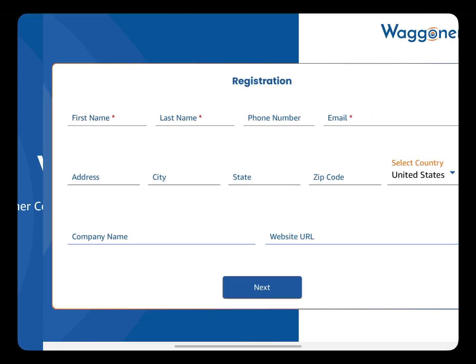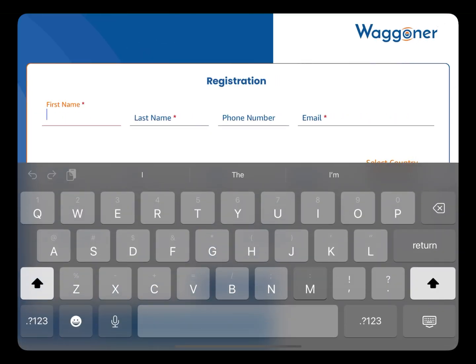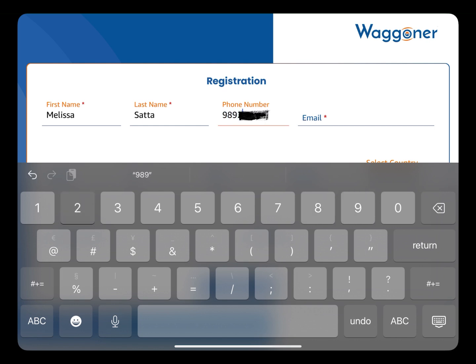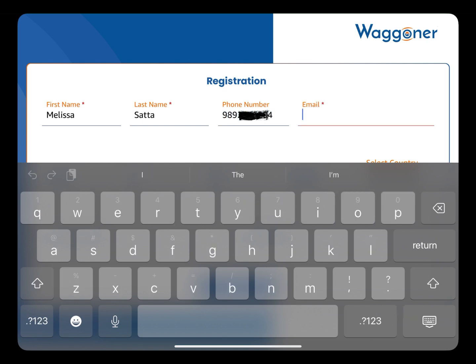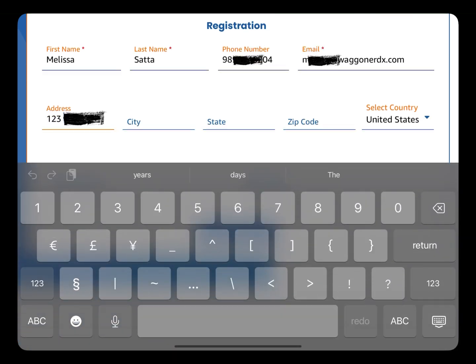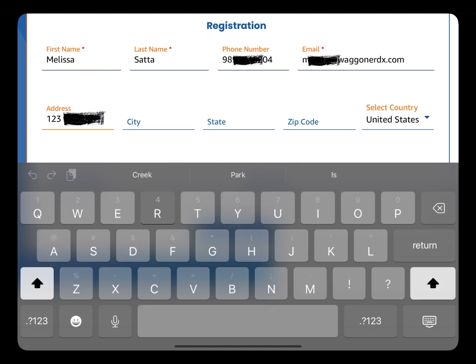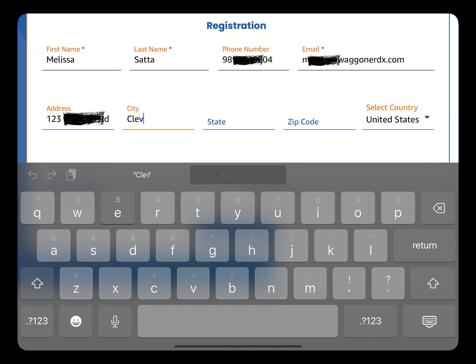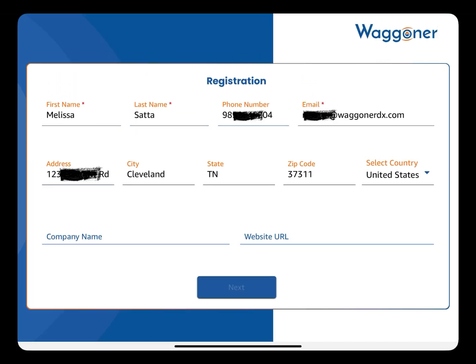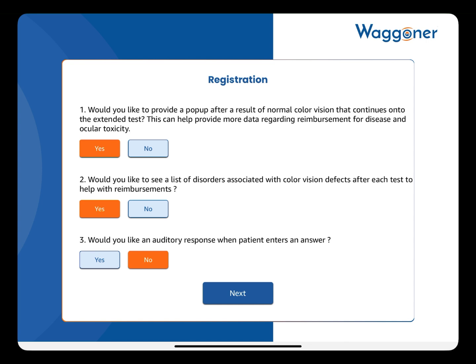You will only need to fill out the registration form once. Enter your email address. The next screen allows you to customize your test administration protocol. The default selections are recommended. You may always update these in the app settings if you change your mind. When ready, click Next.